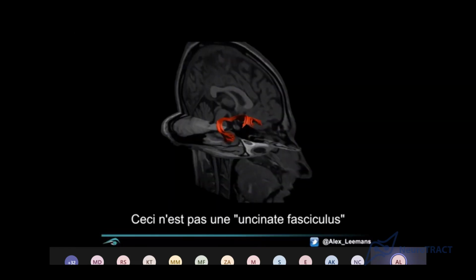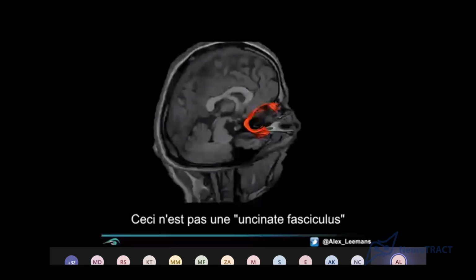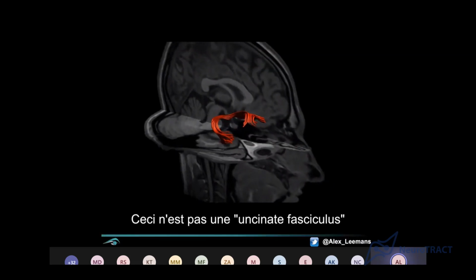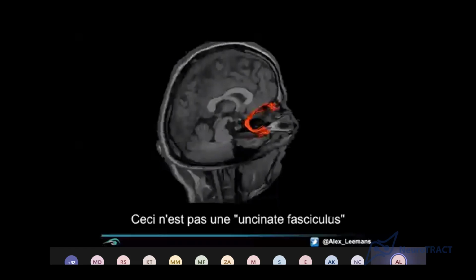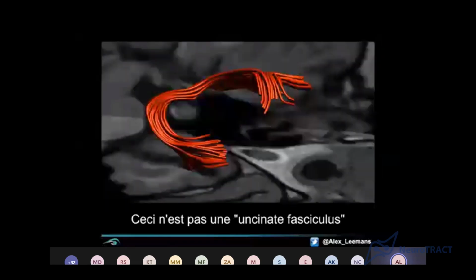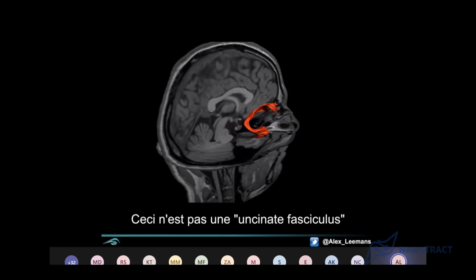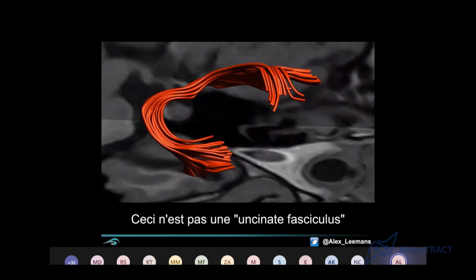It might be more wise to call them tracks, like K instead of CT, because these are trajectories. These are fiber pathways as reconstructed with fiber tractography, which has parameter settings, which is based on the diffusion tensor model, and this model has assumptions, and I'll come back to that later. And so it's an indirect way of reconstructing these fiber pathways. Okay, so although it looks like an uncinate fasciculus, it's not a direct representation of the uncinate fasciculus.